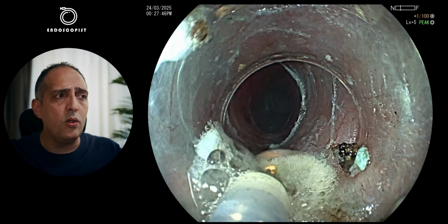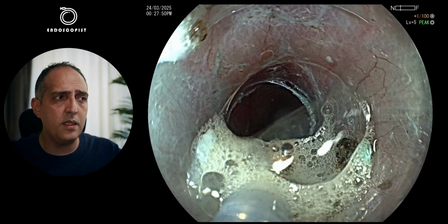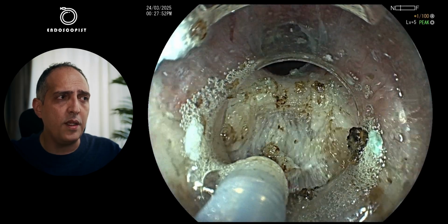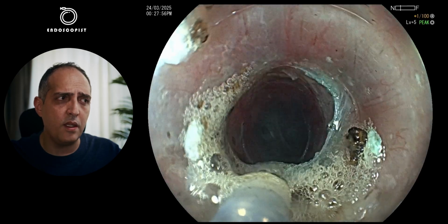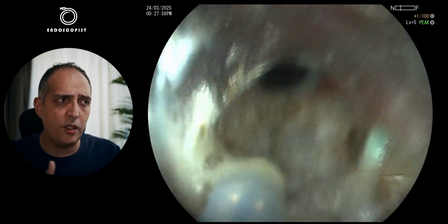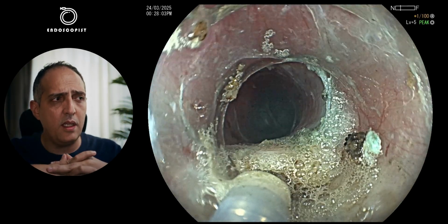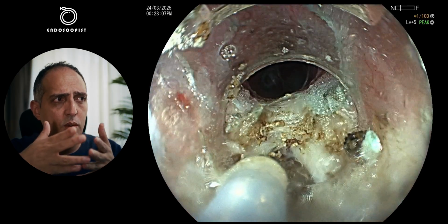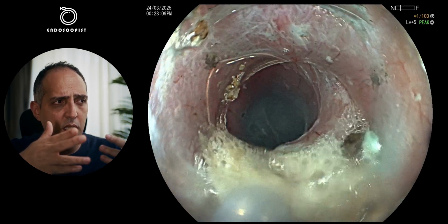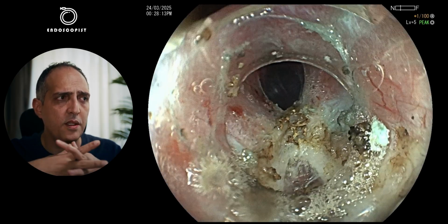So I go slowly, very slowly, cutting millimeter-wise from the muscle layer. Again, I try to keep it as highly selective as I can. Of course, sometimes you will hit the longitudinal muscles, or they are very weak. Usually they will separate from each other, and you will see the mediastinum. But again, I try to make it a target for me to keep it closed. As you can see here at this area, the longitudinal fibers separated from each other, but this is not a problem.